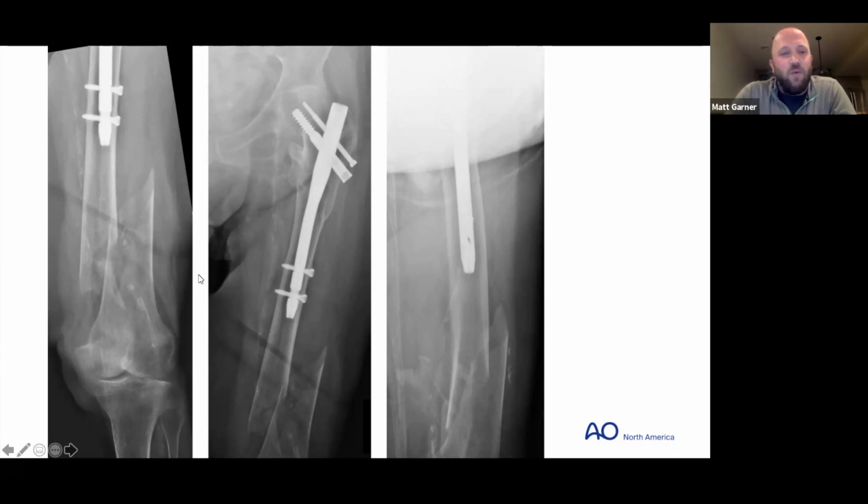I think in an ideal world for a geriatric patient with what's essentially a distal third extra-articular femoral shaft fracture, I would want to get intramedullary fixation with multiple vectors of fixation in the distal block. So, implant choice is a factor there, but I'd want to prevent a stress riser while at the same time protecting the proximal femur. The two different options to do that would be to retrograde nail with the implant that's already there, but you have a very short isthmic segment, a very short shaft segment. So the length of the implants becomes a limiting factor. I think in an ideal world, I would remove the proximal implant, put in a DHS, and retrograde nail, similar to if this was a segmental femur fracture in a younger patient.